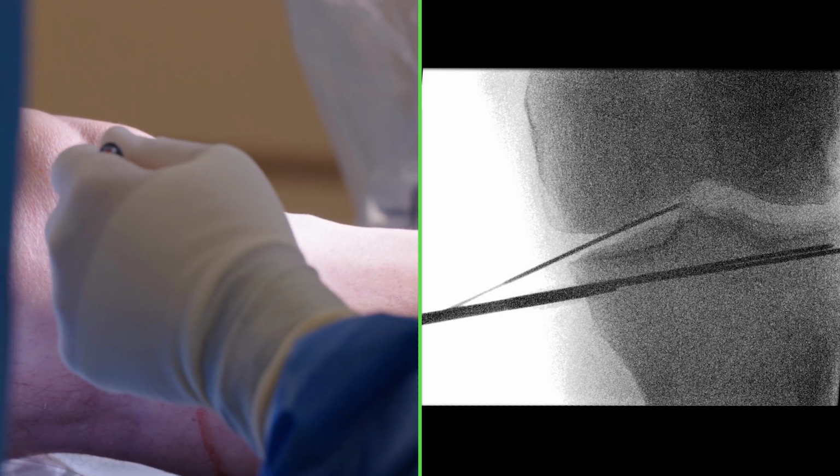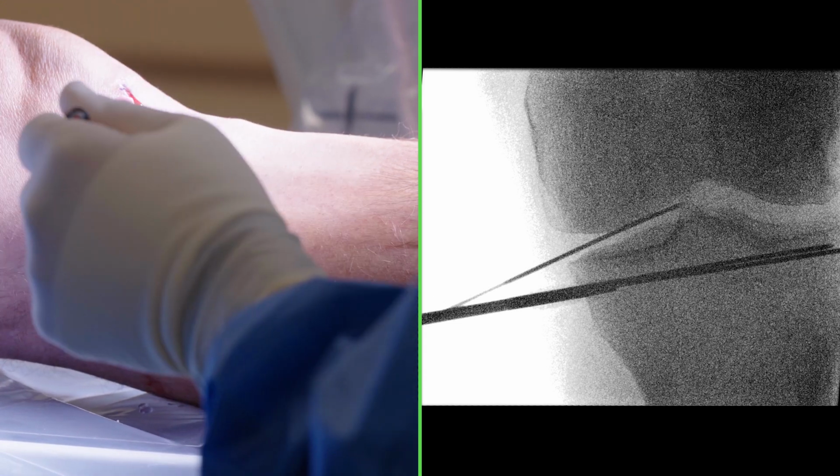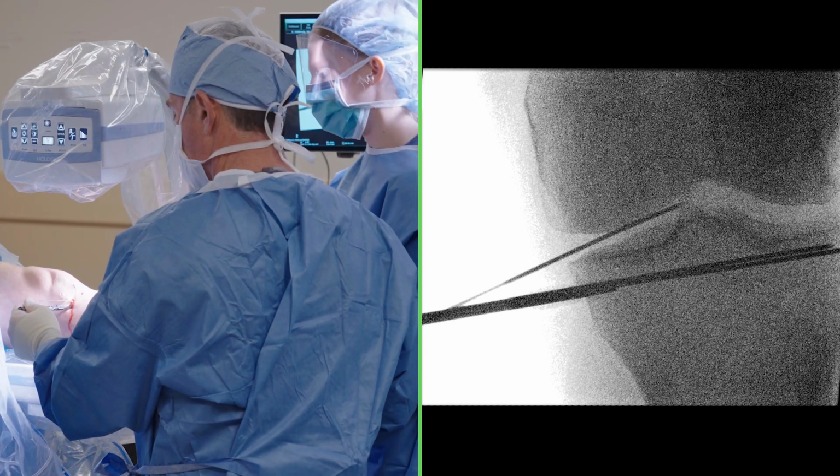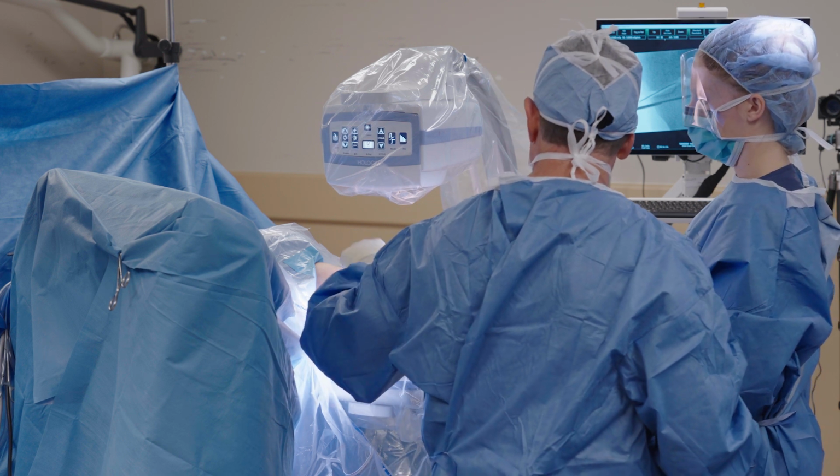So that's about right. So 65 for the anterior one. We're going to prove it with the drill. And the posterior one is 70. Okay? So that's helpful. I'm going to remove the spinal needle.